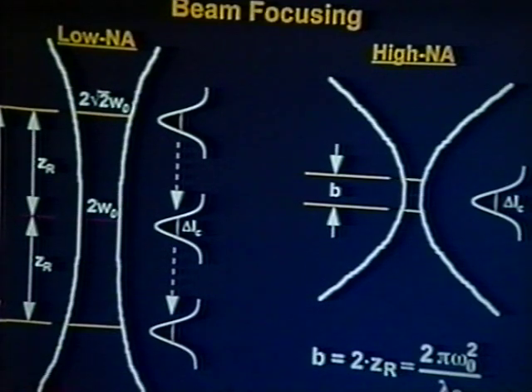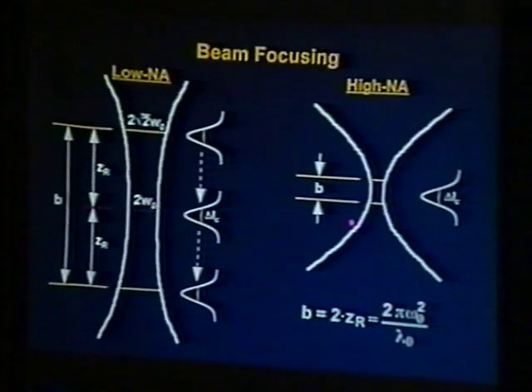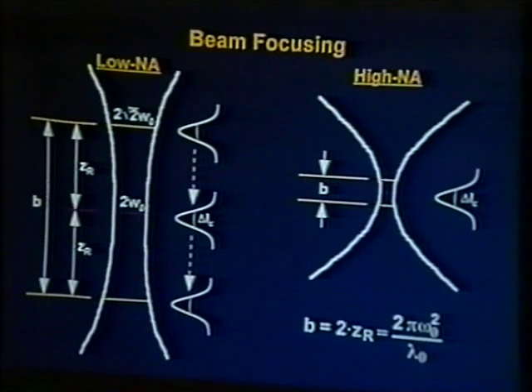Sources. We've used a variety of sources over the years. Solid state lasers, and I'll show you an example of that in the next slide. Doped fibers, we've used them. They have problems associated with them. The spectrums tend not to be Gaussian. It's hard to get the appropriate bandwidth, and they're low power, and it's often difficult to find the appropriate pumping sources.